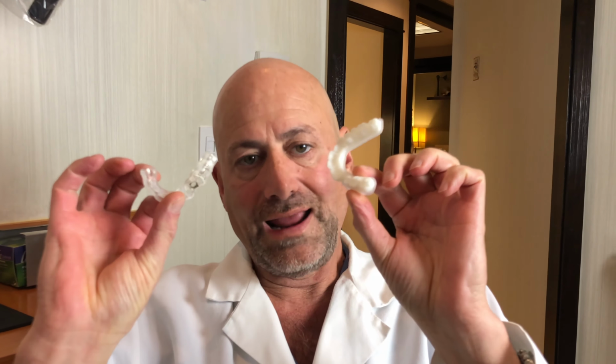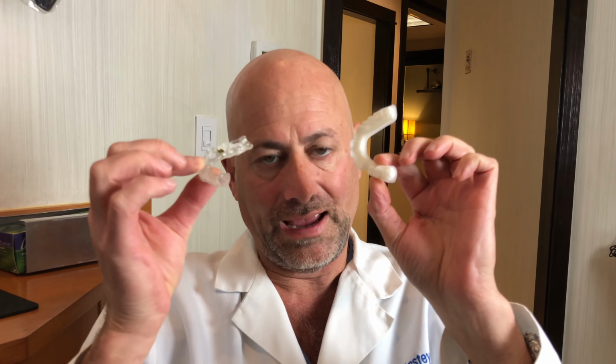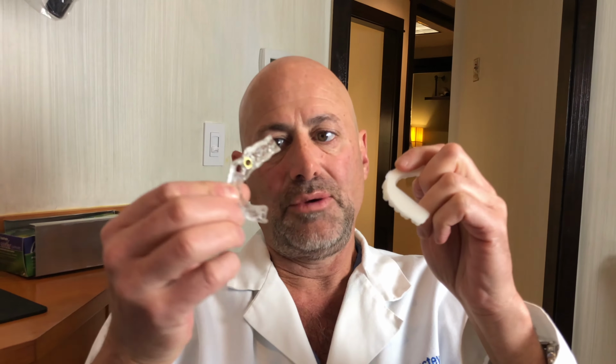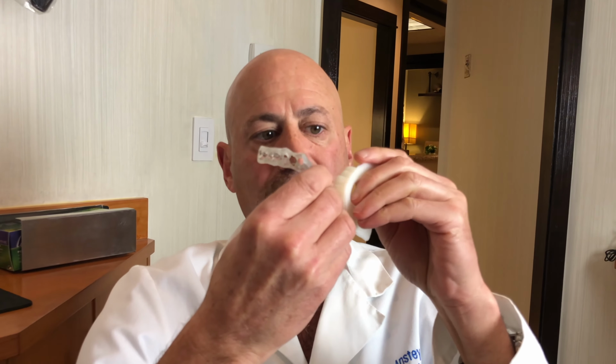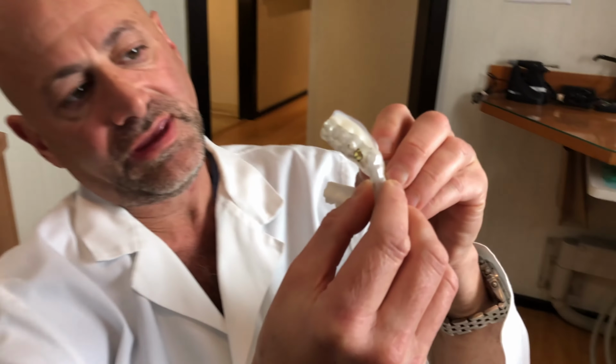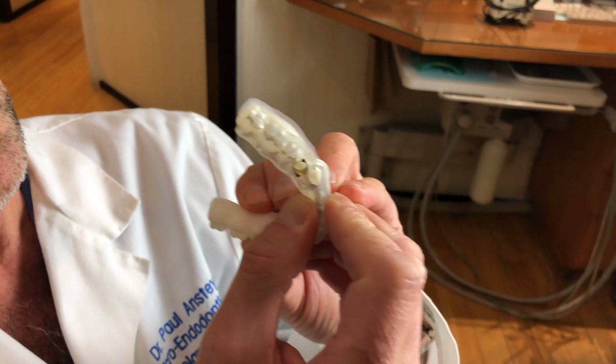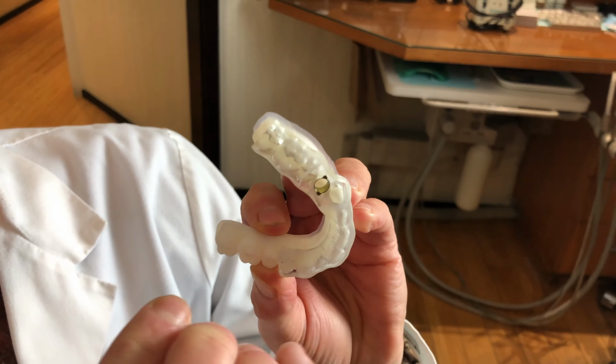So then what happens during the surgery with this 3D printed model and 3D printed guide is that I know exactly through this little gold hole here on the implant, on the surgical guide, I know exactly where the position of that implant is, not only in this dimension, but in 3 dimensions. We have tools that fit in there.